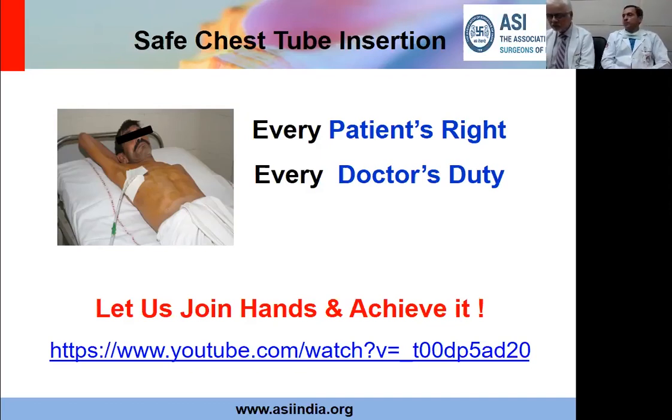It should not be too far towards the anterior fold either. It should be in such a way that when the patient is lying down, the chest tube is draining without any kinks and cuts. I think it clearly states what should be done in this situation.